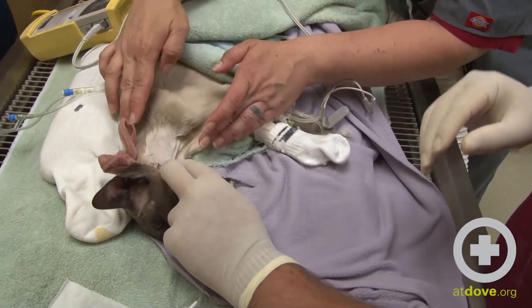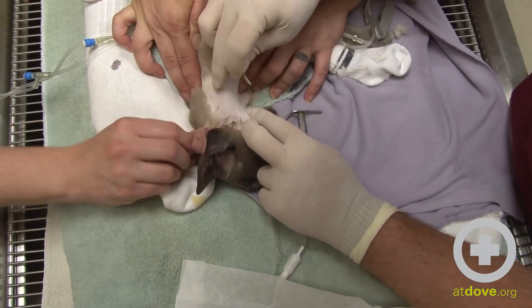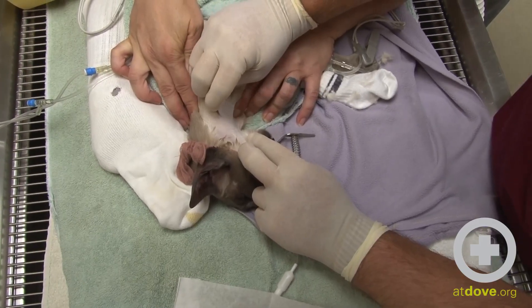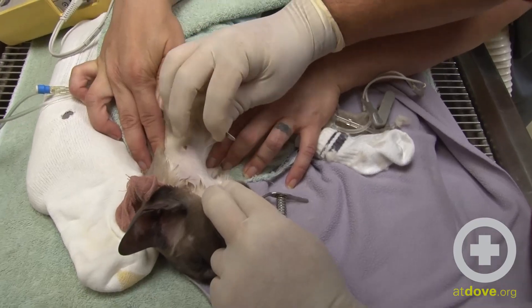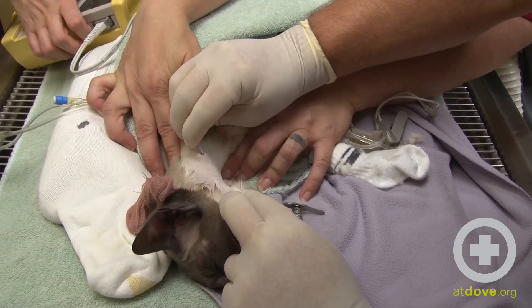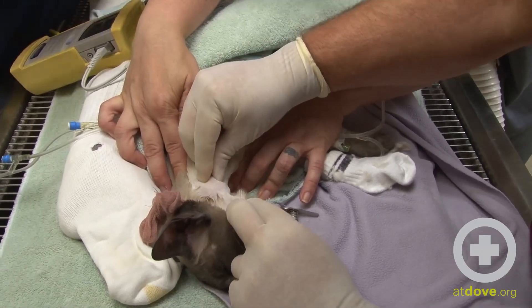It is helpful to have an assistant stretch the skin out a little bit, which will make it easier to make the incision over top of your carmalt forceps. Here we are making our skin incision right over top of the carmalts. You don't want to make the opening too big — as soon as you see the carmalts poking through, that's good enough. Just make an incision through there.